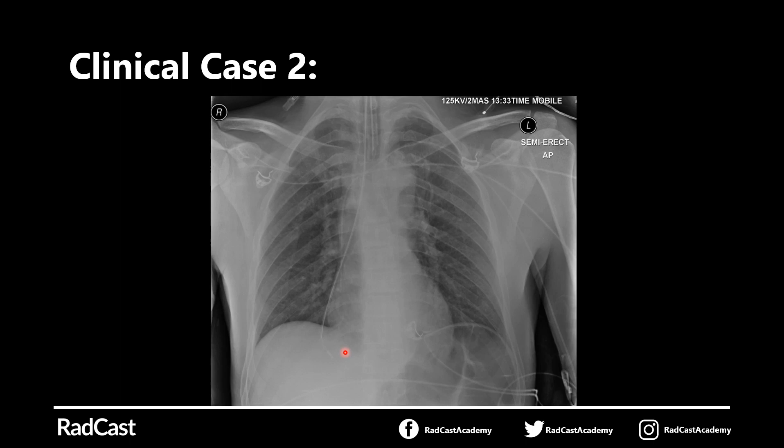This will be harm that we have inflicted on the patient, known as an iatrogenic injury, and that's certainly not the aim in medicine. So it's very important that this is recognised and the NG tube is immediately withdrawn.